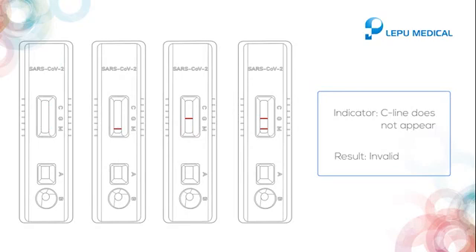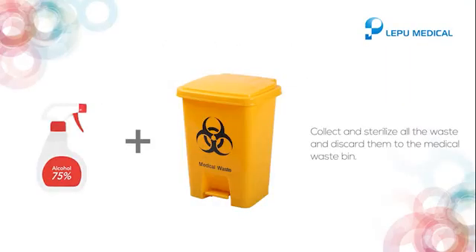If you did not see the C line in the result, then the test is invalid. Collect and sterilize all the waste and discard them in the medical waste bin.